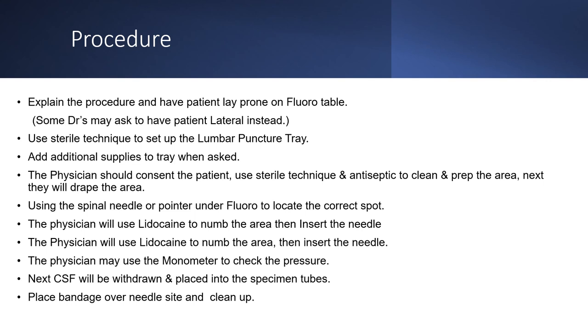The physician may use a manometer to check the pressure. The CSF will be withdrawn and placed into specimen tubes. You really need a lot of drops of specimen for a lot of these tests.